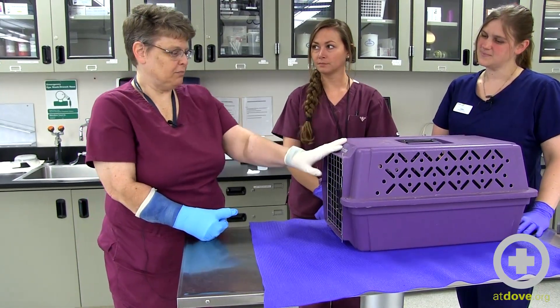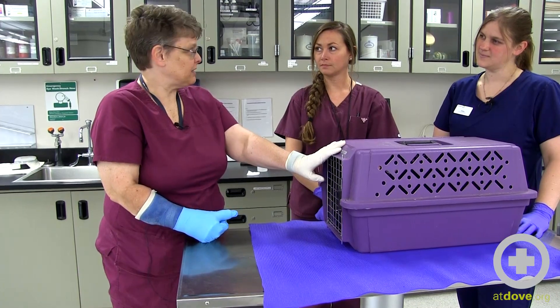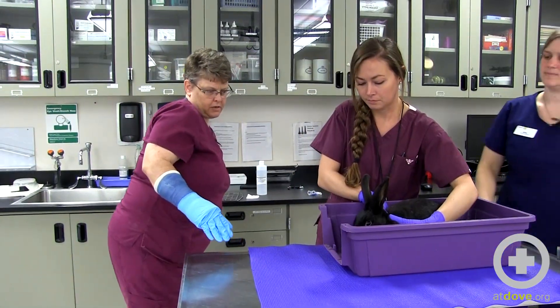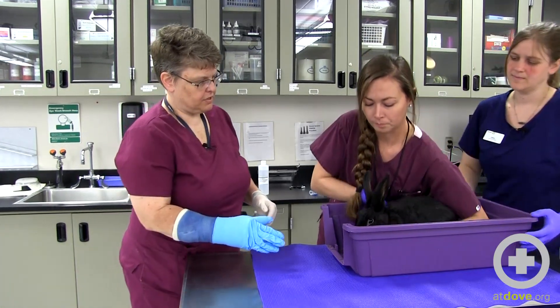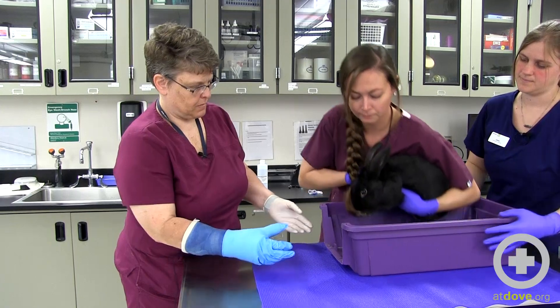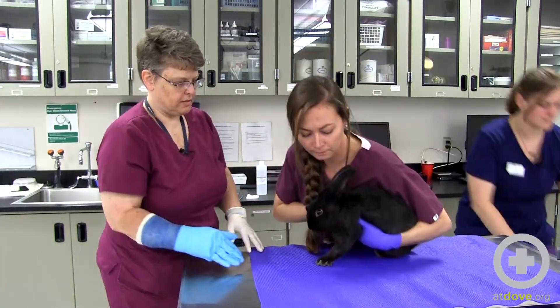So this little rabbit — his name's Ziggy — was brought in in this cat carrier essentially. Elisa is going to pick Ziggy up and she's going to make sure to kind of tuck his back end in, and then just sit him right on the table.